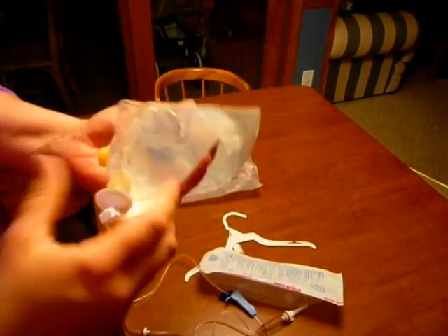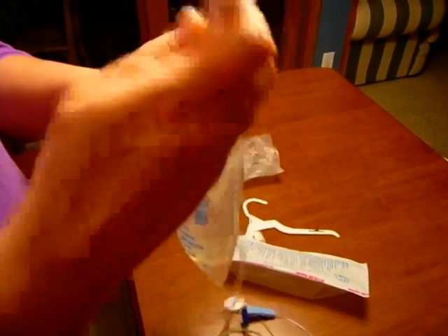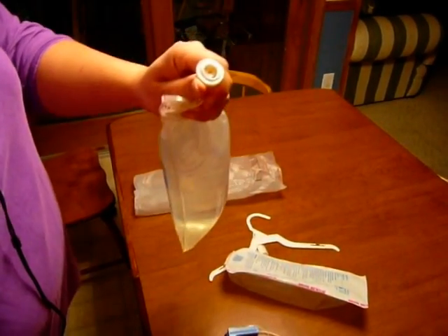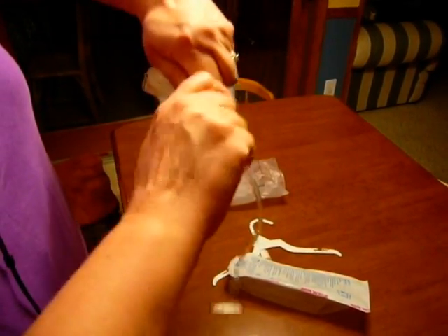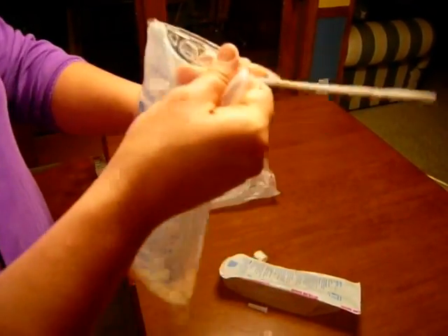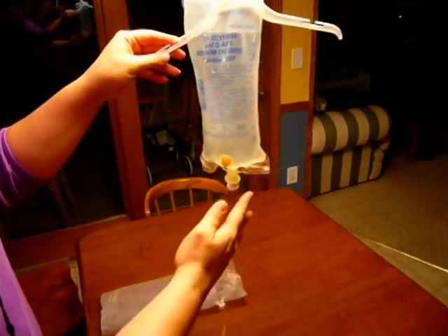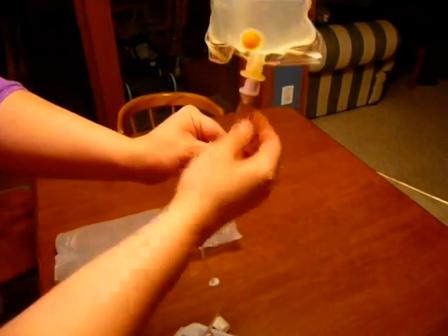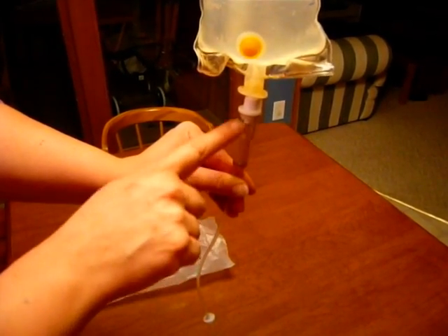Once I've done that, my solution is ready to go as well. The next thing I'm going to do is prime my tubing. I need to get ready by getting the IV bag in my non-dominant hand and my spike in my dominant hand. I'm going to pull off the sterile cover of the IV bag and the spike, and insert the spike into the IV bag. Next I have to hang my IV bag up on an IV pole. Then I need to fill my drip chamber at least halfway by squeezing and letting go about two times so there's fluid in there but I can still see it dripping.